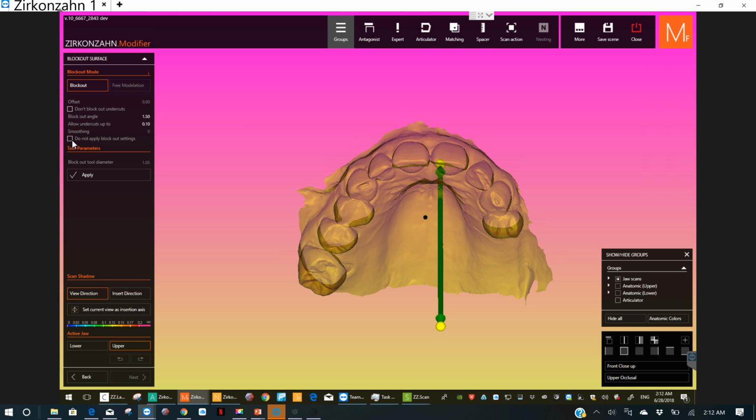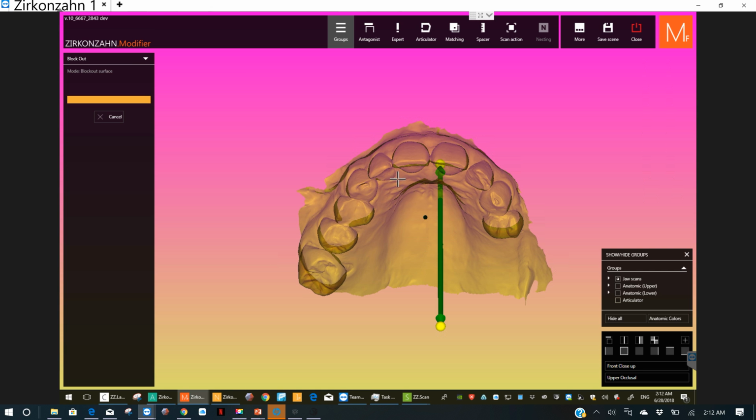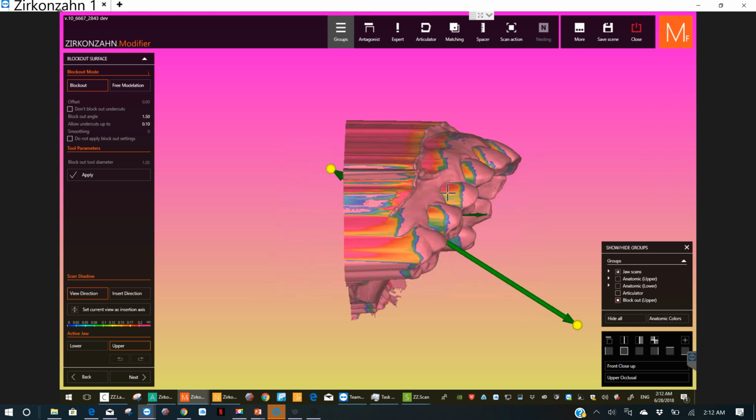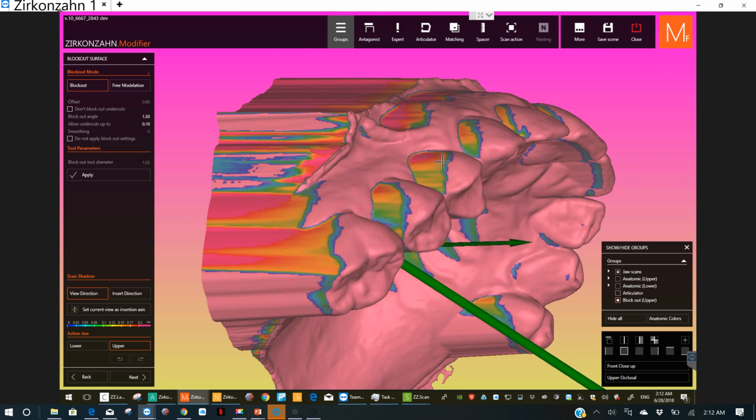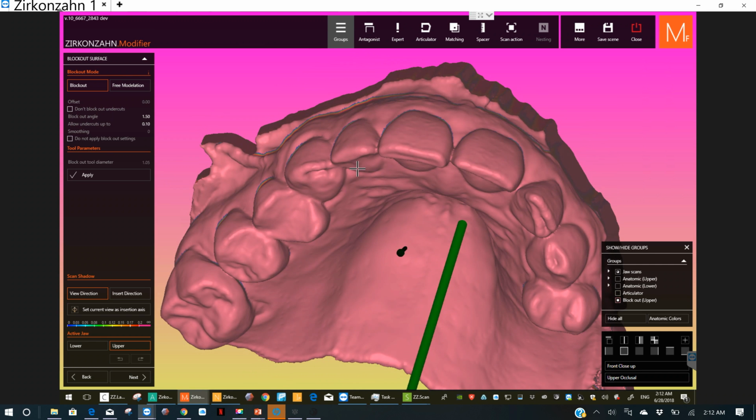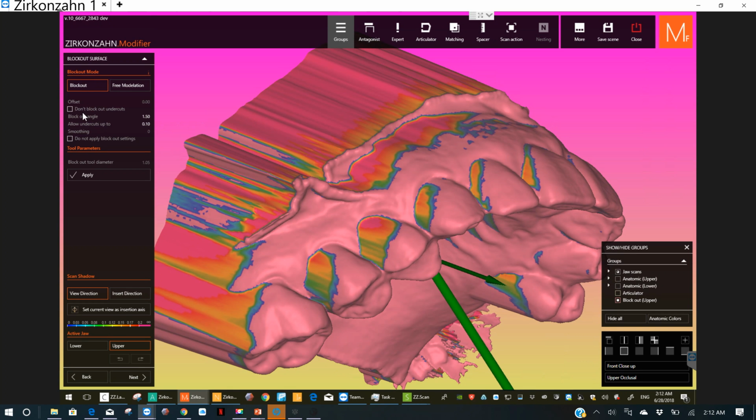And we want to block out undercuts. And let's apply. And what it's going to do is block out this model so there's no undercuts. Because if we made an appliance that fit to a model that had undercuts, it wouldn't go on. Turn it to the side, you can see it's blocked out. There's no undercuts, like that area right there curved in, and we couldn't mill something that would go in there and then have it slide on over the teeth. So this is the blocked out model. And by changing that angle right there, that's the angle that it blocks it out. So if these things are going in a little snug, we just increase that angle.